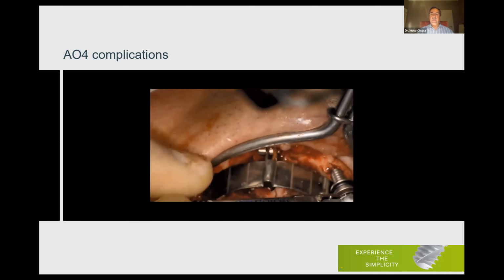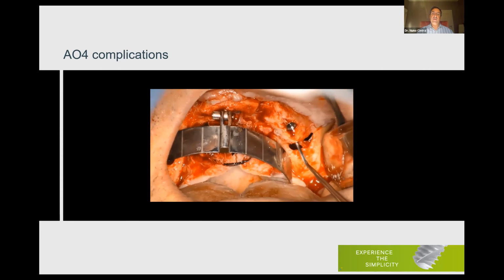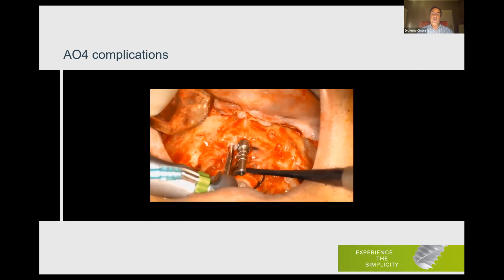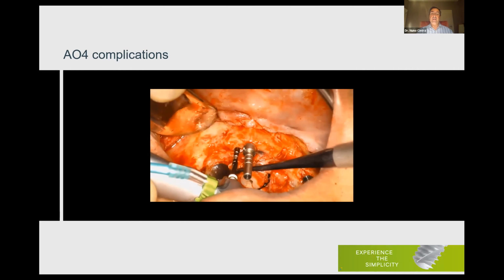So remember the guide is for the posterior implants, the posterior abutments. For the anterior ones, we don't need it. Of course, I checked to see if there were any threads exposed. There were not. And for the anterior implants, we don't need that titanium guide. We just need the pin rod. Okay. So with the 2 millimeter drill, we will decide how to use the other drills.